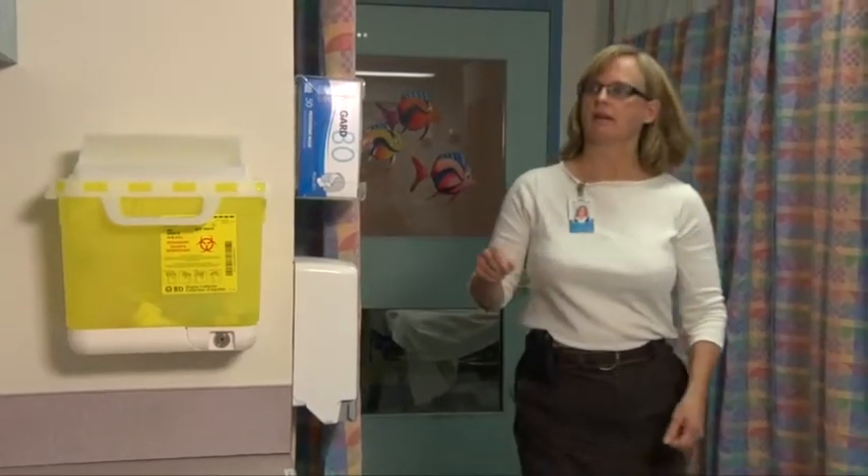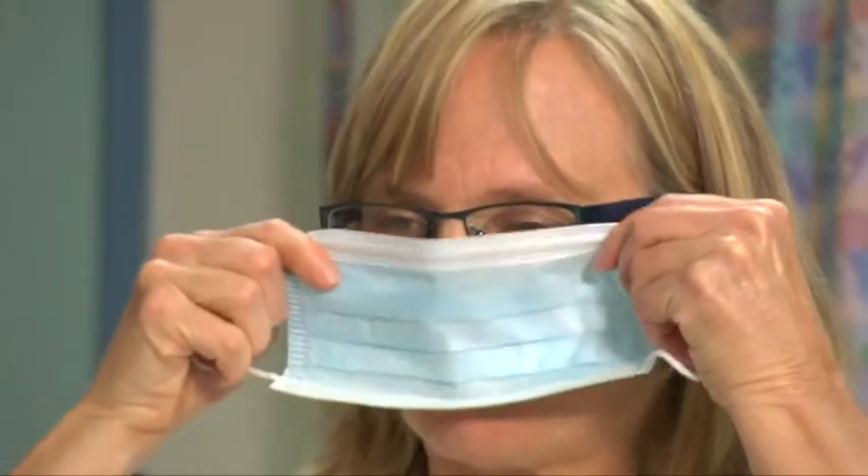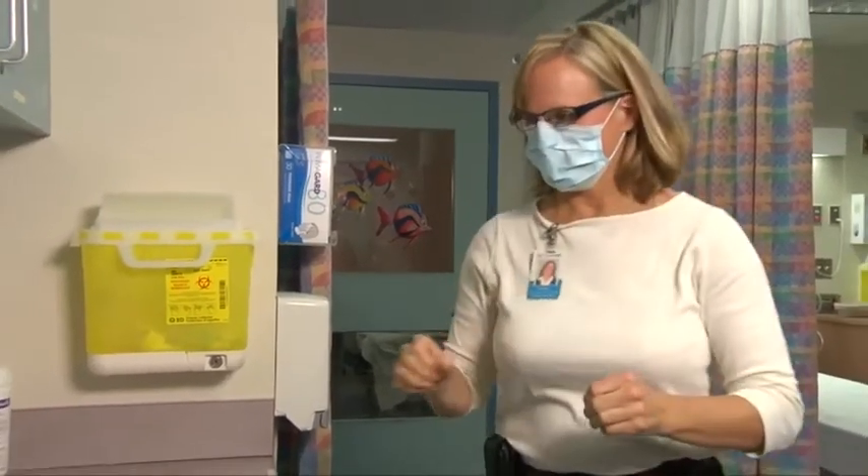Staff who have chosen not to be immunized against influenza, or who are medically exempt, should remove a surgical procedure mask from the box by grasping the ties or loops on the mask. Place the mask over your nose, mouth and chin before pinching the metal clamp firmly around your nose.